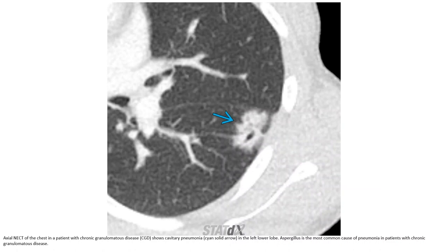This is a non-contrast CT of the chest in a patient with chronic granulomatous disease, showing cavitary pneumonia in the left upper lobe. Aspergillus is the most common cause of pneumonia in patients with chronic granulomatous disease.